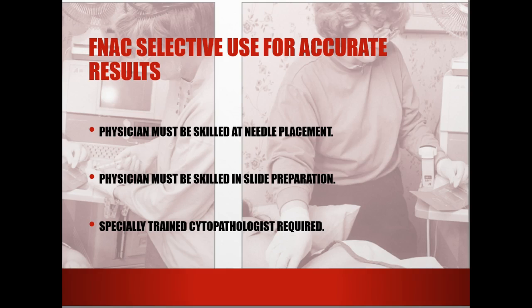That can be put into the breast up to a month, and some vendors are coming up to where it's more than a month before she has the surgery. And then they just need to go to the surgery. Say you put it in today, next week they go in for their surgery. The surgeon has a little device that can find the signal of that clip that's in there. So it gets rid of this whole needle wire hassle, and it also helps with the coordination of everything.